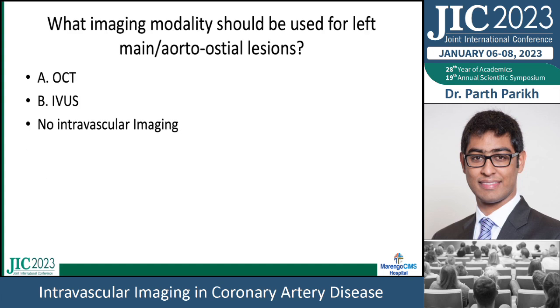So just a couple of questions to go over. I know we're almost above time. So what imaging modality should be used for left main or aortoostial lesions? OCT, IVUS, or no intravascular imaging? So over here, the correct answer is IVUS.